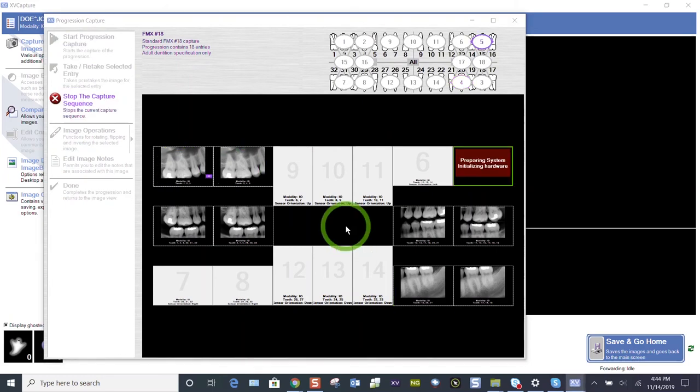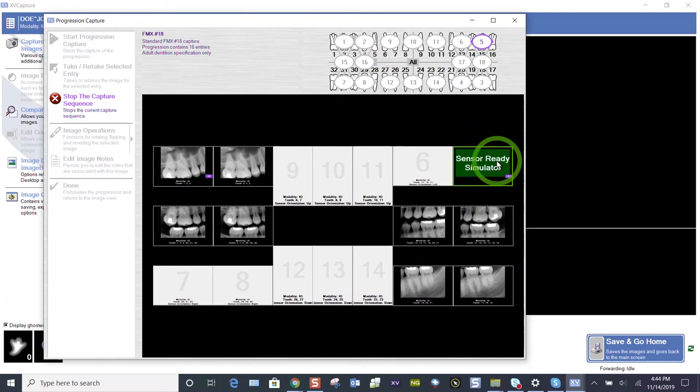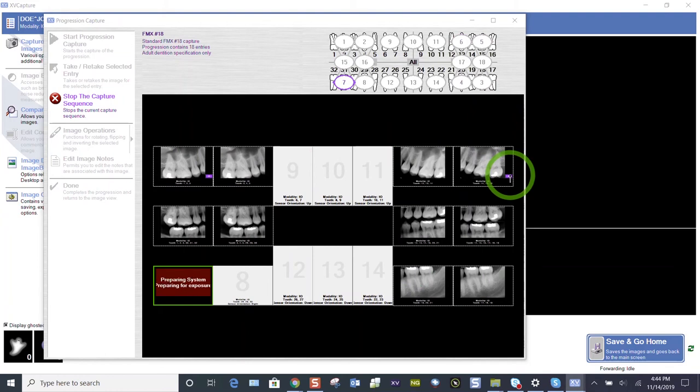We're going to demonstrate that one more time. This upper left molar shot. If I don't like it, highlight that tile. The sensor is ready. I take it again. We'll see those numbers in the lower corner.